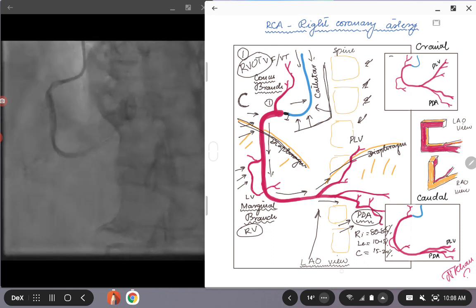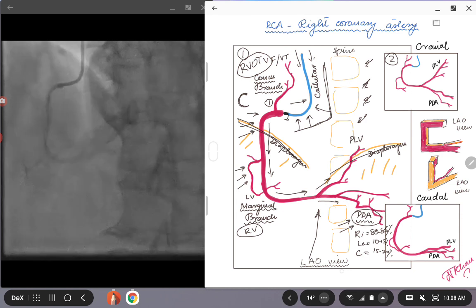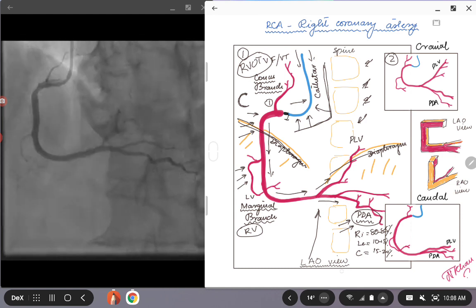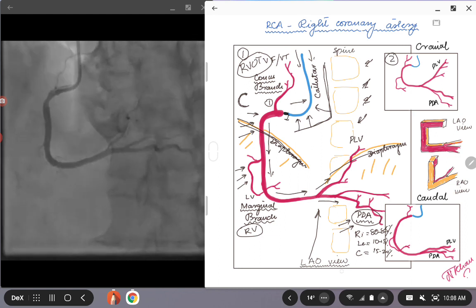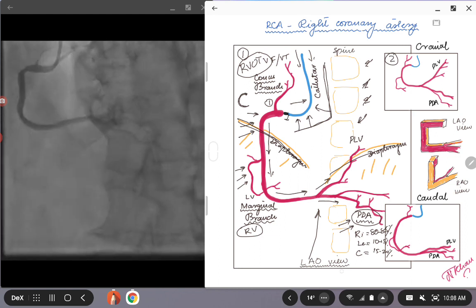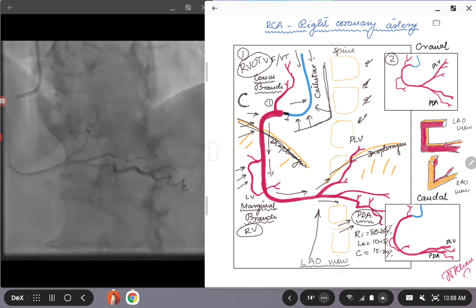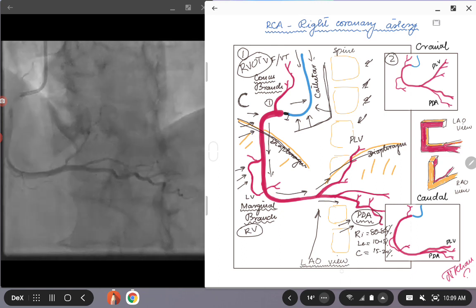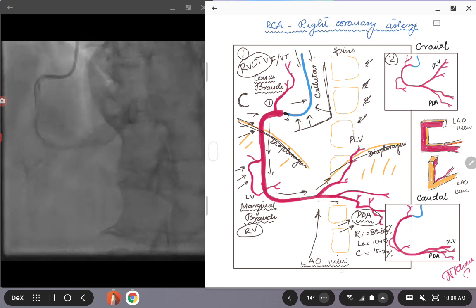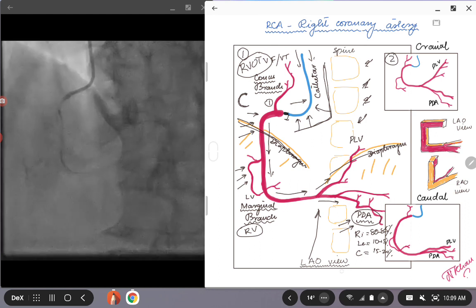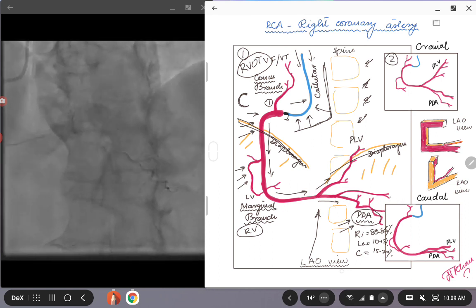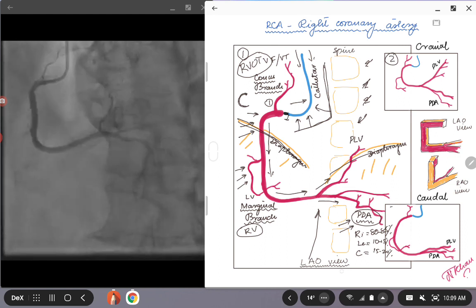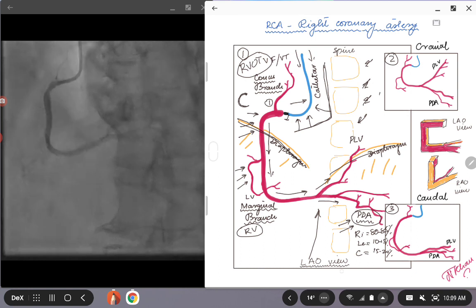With that, we move on to picture two here. As I said, this view is a straight LAO view where you have not added any cranial or caudal angulation. And as I said, since it's only one artery going to the right side, it's relatively easy to look at that artery without putting any cranial or caudal angles to it. But in some patients, you might need to look at the body or the bifurcation of the right coronary artery, and that's when you might need some degree of angulation. It can be either cranial or caudal.